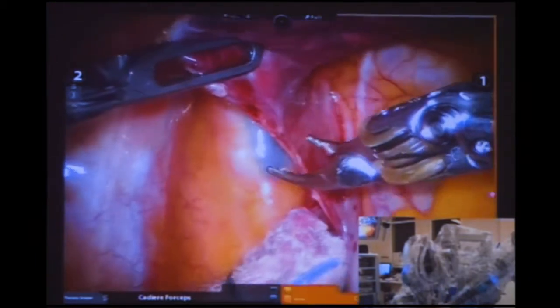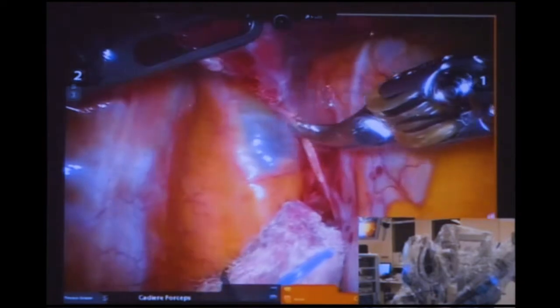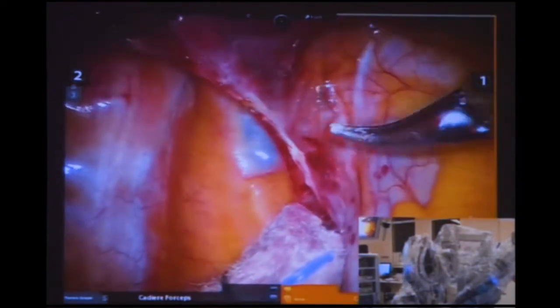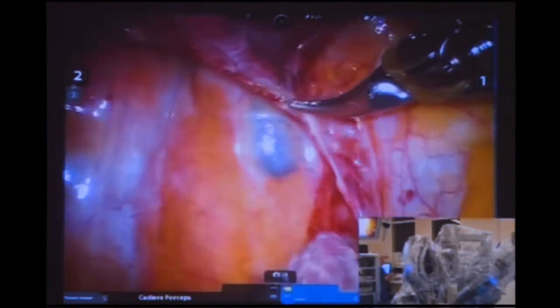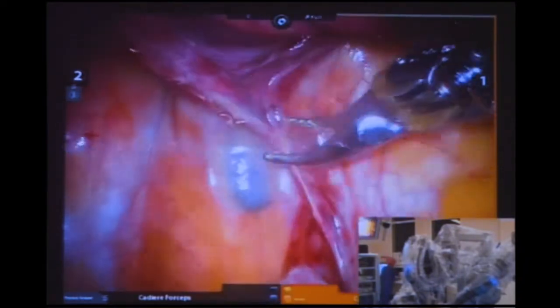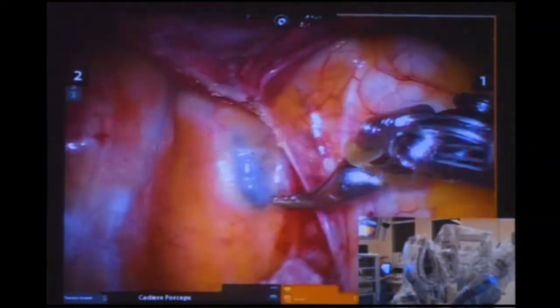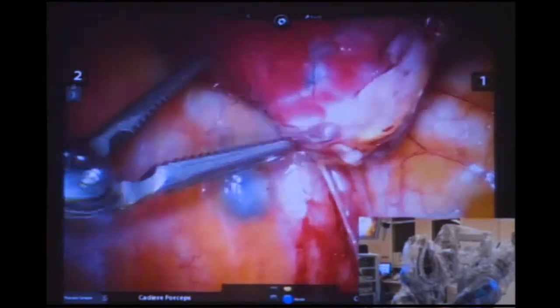This is the bipolar — you can use a hook, but I quite like this pinching motion. I don't think it's the best diathermy approach, but you can get around vessels without changing arms in the patient. It's a nice clean way to work — things that slow you down in robotics are bad camera vision from dripping and constantly changing arms.